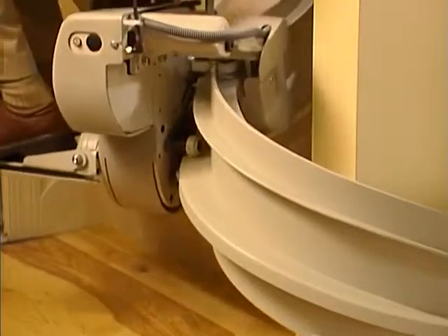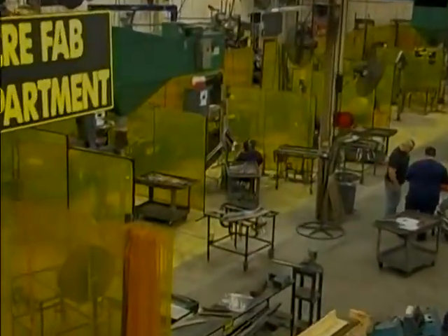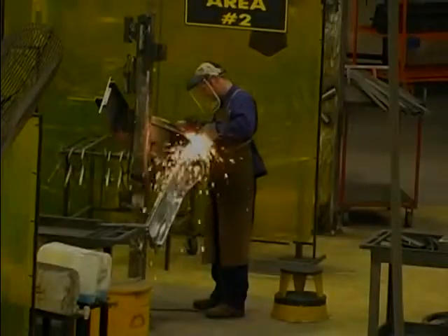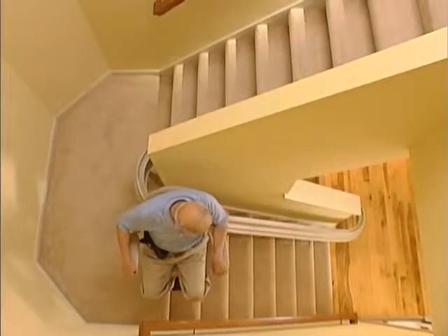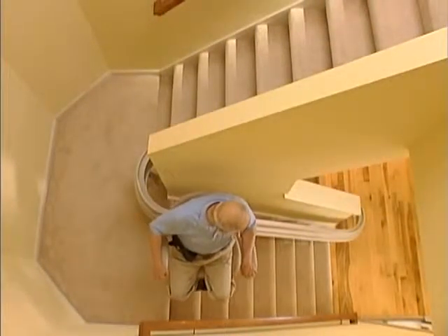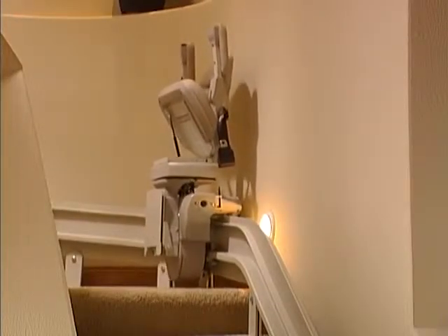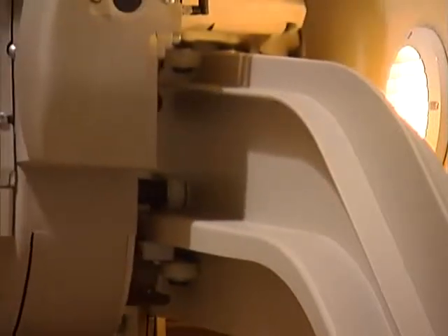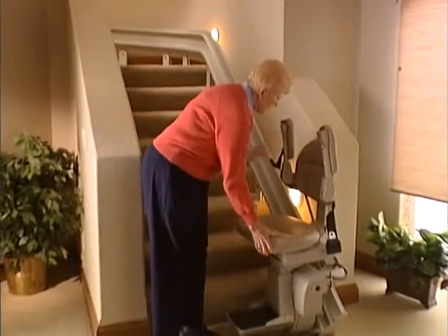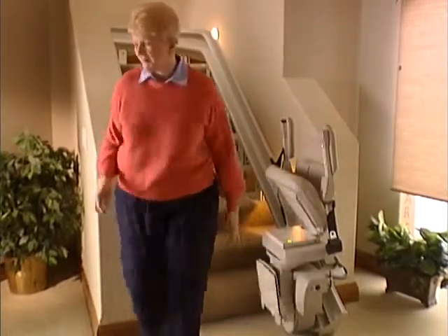Every Elite Curve is a work of art. Its gently curved rail is handcrafted by skilled artisans from exact measurements of your staircase. No stairway modifications are required when the rail, carriage, and seat are installed. The exclusive design of the rail and mounting clamps can place the rail as little as 7 inches from the wall. When the unit is not in use and the seat, armrest, and footrest are folded, there's plenty of room for family and guests to use the stairway.